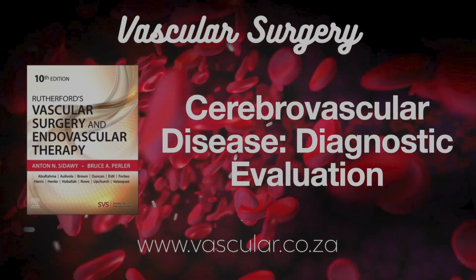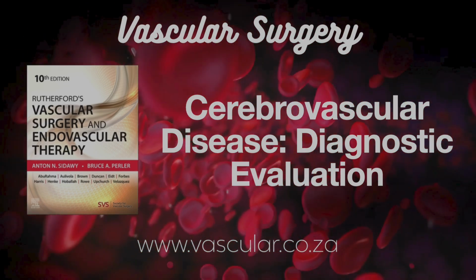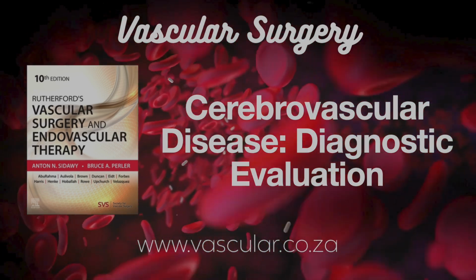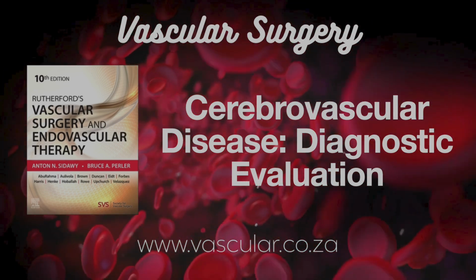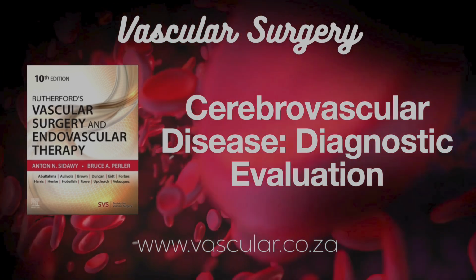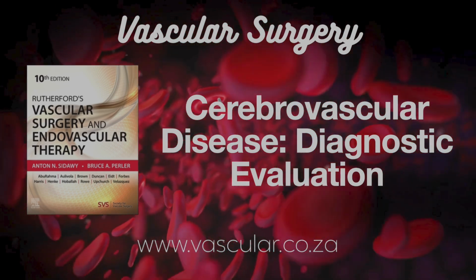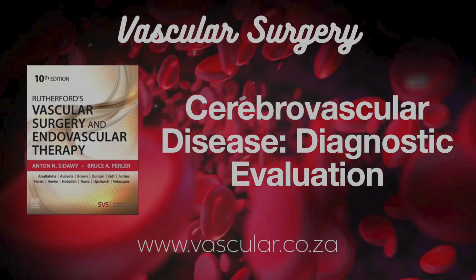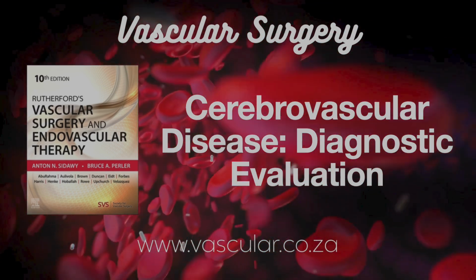Still something to consider. And one more thing. If there's a lot of dense calcium, sometimes on the CT images, it can be hard to distinguish the bright contrast inside the vessel from the bright calcium in the wall. Makes measuring the true opening tricky in those cases. And maybe in really complex situations like multiple narrowings close together, or if the artery is supercoiled, CTA might occasionally struggle to give a perfectly accurate picture of every single stenosis. Right. Contrast issues, radiation, calcium interference, important trade-offs.